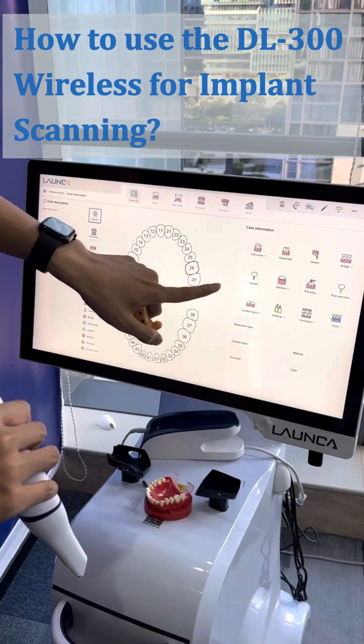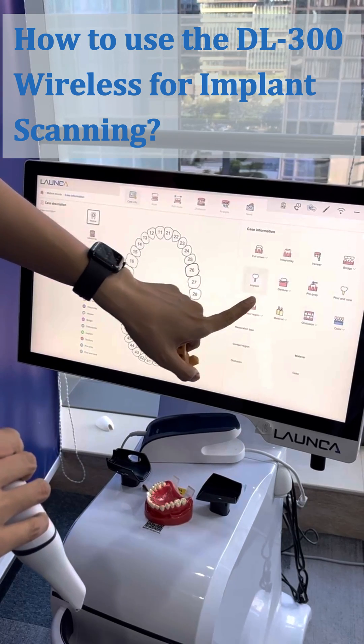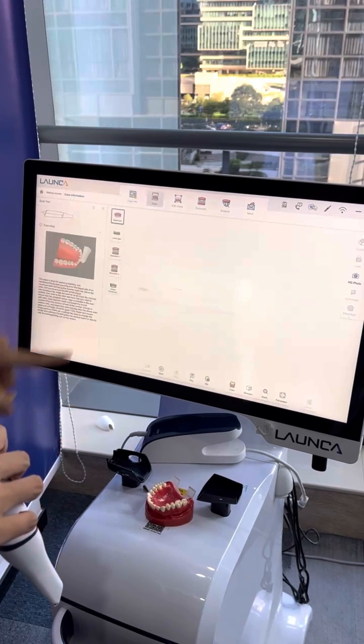First of all, you need to select and register as an implant case. Select the tooth first, choose the implant, and then go to the scan page.